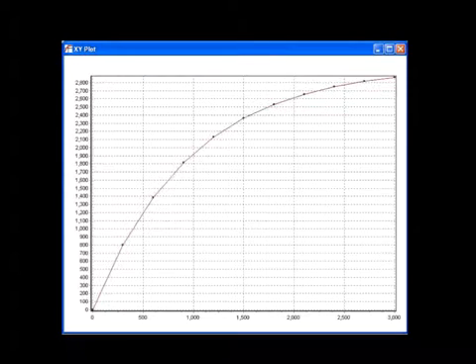And if you go another time constant, you gain 1 minus 1 over e of the remaining 37%, and then you get to the high 80s, maybe 87 or so. That's the 90% I was referring to after two buildup constants. It's just a rule of thumb. You can do this however you want, but usually you're in good shape if you've got 2 buildup constants worth of polarization.